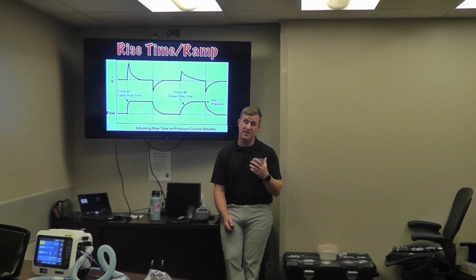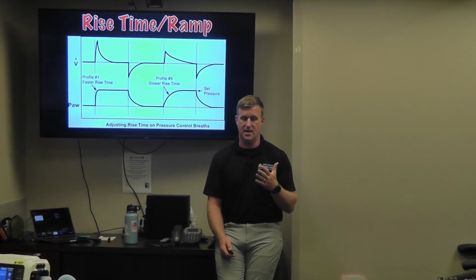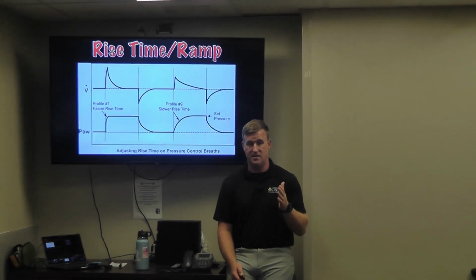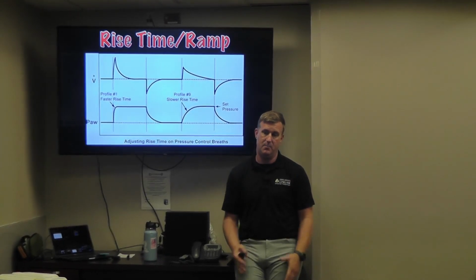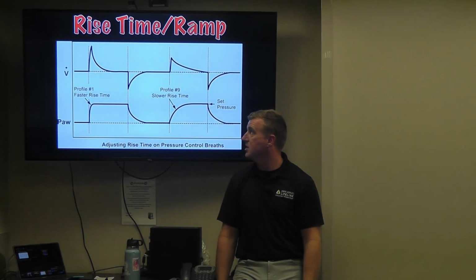You're going to find a common theme as we talk about mechanical ventilation. Every ventilator manufacturer got together. Maybe they didn't get together, maybe they just all stayed separate. But they all decided they're going to name their things whatever they feel like. The same thing on one vent is labeled something completely different on another vent, which makes it much more difficult to talk about from a global standpoint. But we're going to try.